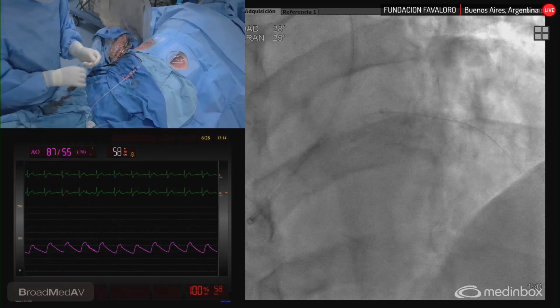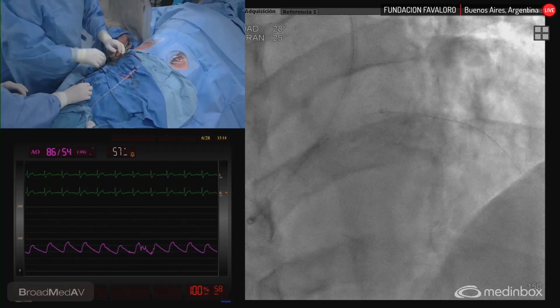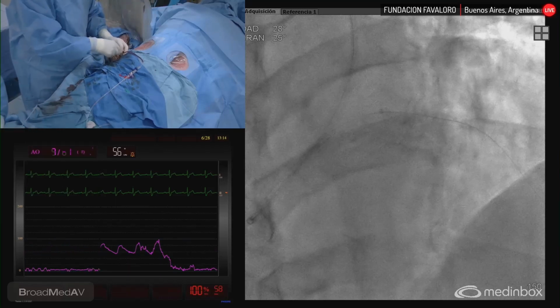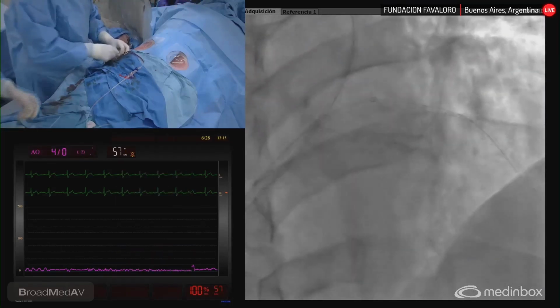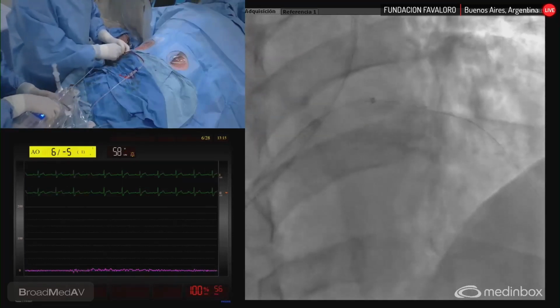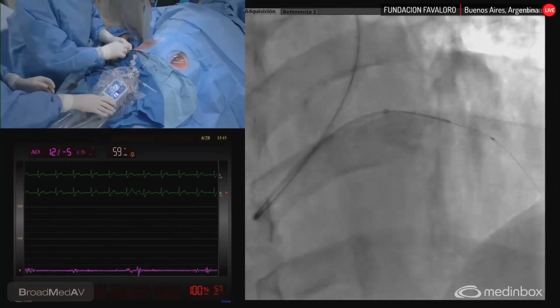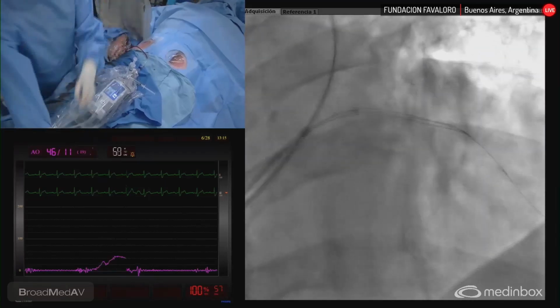In the case of an emergency situation, I would have to use the balloon. We haven't thought about that because we have a huge right coronary artery. So with the patient, we preserve left ventricular ejection fraction. So I think this is not in our regular practice to use a left ventricular assist device. Camilo? Probably because of the limitations and also because of the history that we haven't had. Oh, well, we are successful.